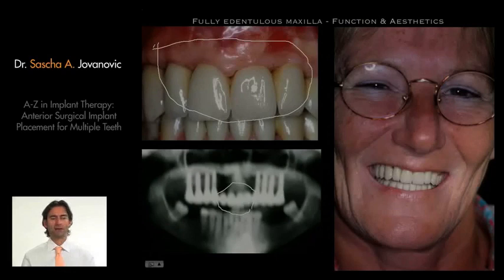So this area will only be treated with pontics, and this is a 12-unit bridge. It could be a 6-unit bridge going from canine to canine, if you make it in segments. And the ridge has been augmented, usually with soft tissue grafts only. The advantage of this treatment is that you have no implants there, so aesthetically you can control it.